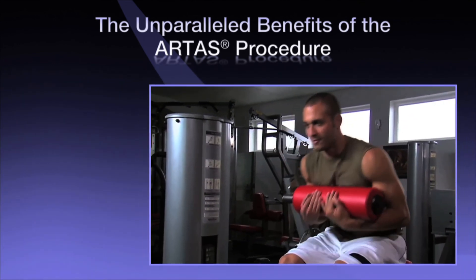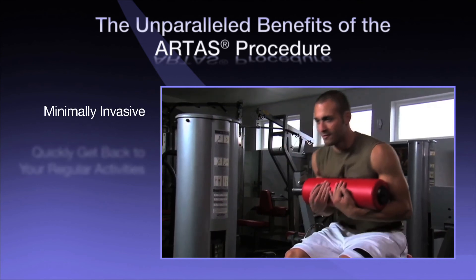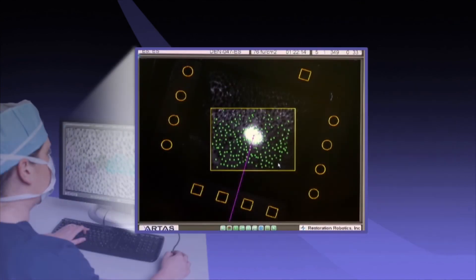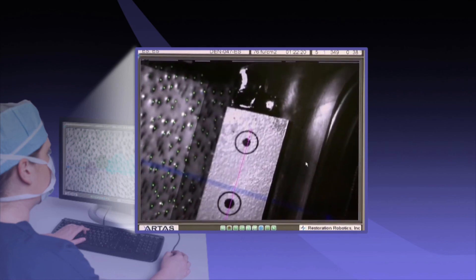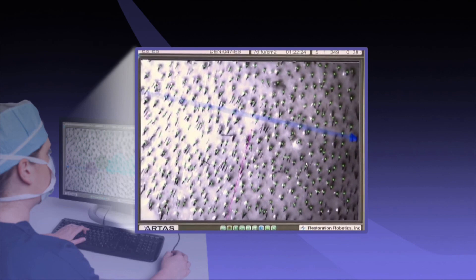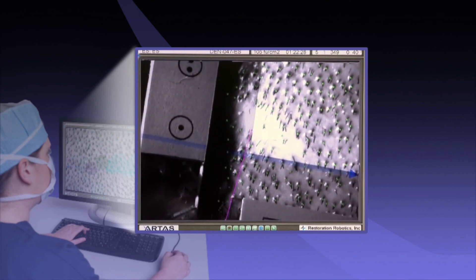The advanced digital technology and precision robotics behind the ARTAS system help deliver a revolutionary hair restoration procedure that is minimally invasive, allows you to quickly get back to your active lifestyle, and delivers consistent, healthy, and natural results. ARTAS empowers doctors to digitally identify and track each follicular unit with pinpoint accuracy, calculating parameters such as hair angle, distribution, and density.